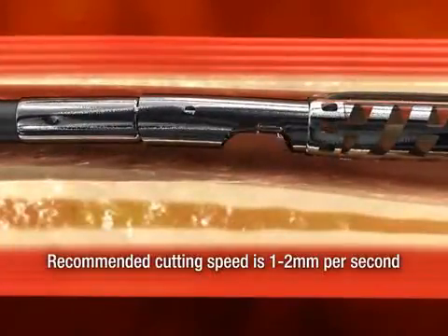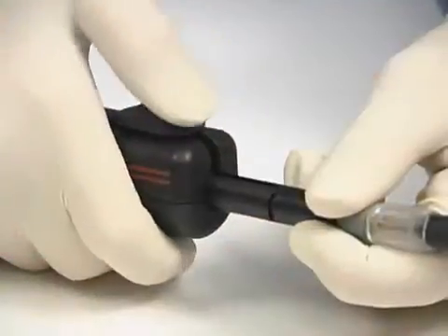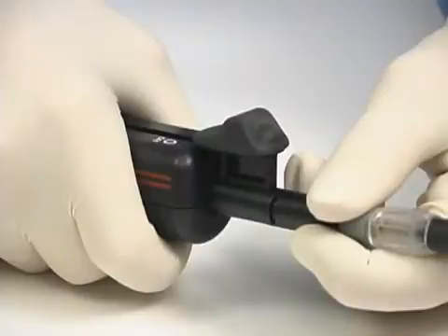Once the end of the target segment is reached, stop advancing the catheter. Carefully advance the cutter positioning lever to close the cutter and turn off the cutter driver. This will be indicated by a tactile click.